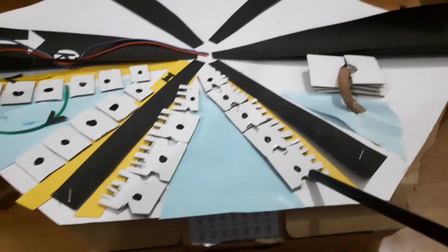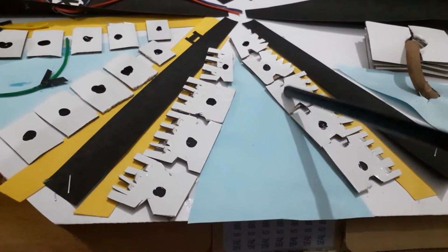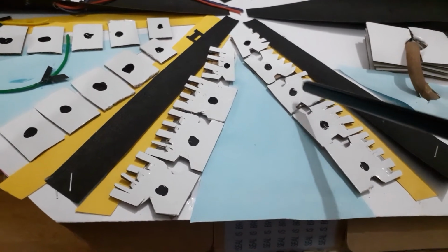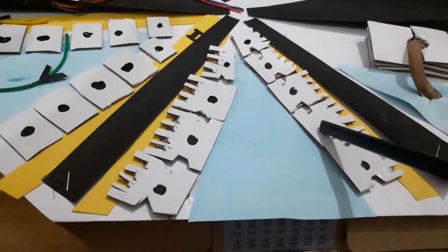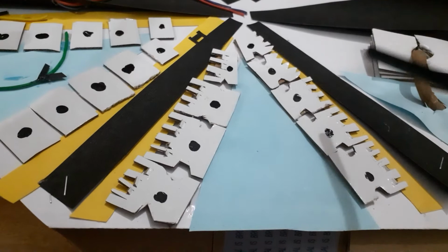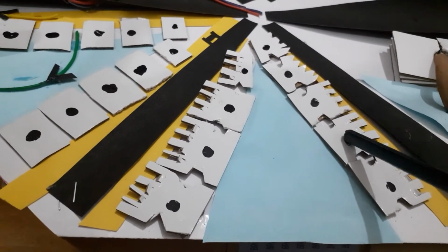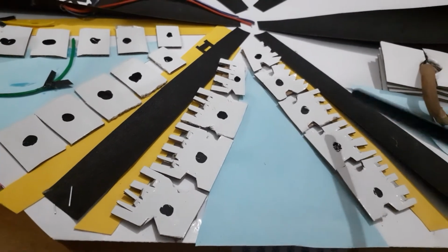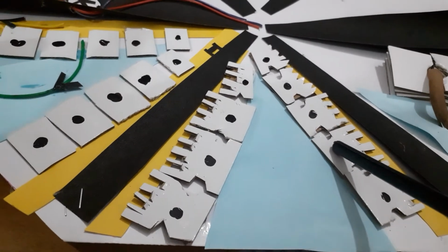And this hepatocyte, this is the nucleus. This black one is the nucleus, and it becomes enlarged as the age increases, and also becomes many in number as the age increases. And it is full of peroxisomes, lysosomes. There are many mitochondria inside. The smooth endoplasmic reticulum and rough endoplasmic reticulum are there.